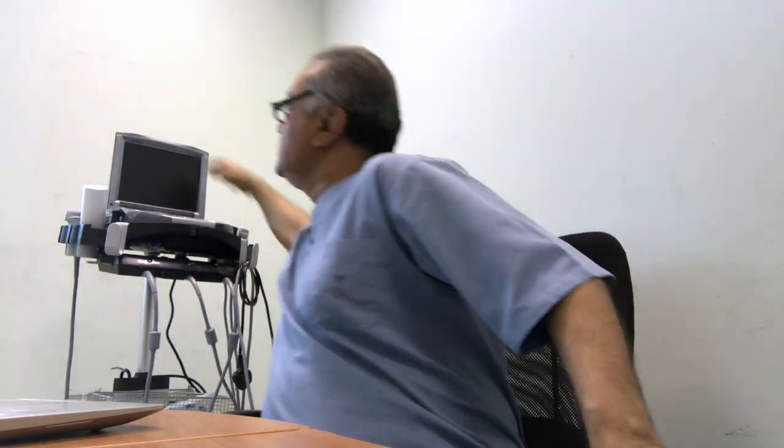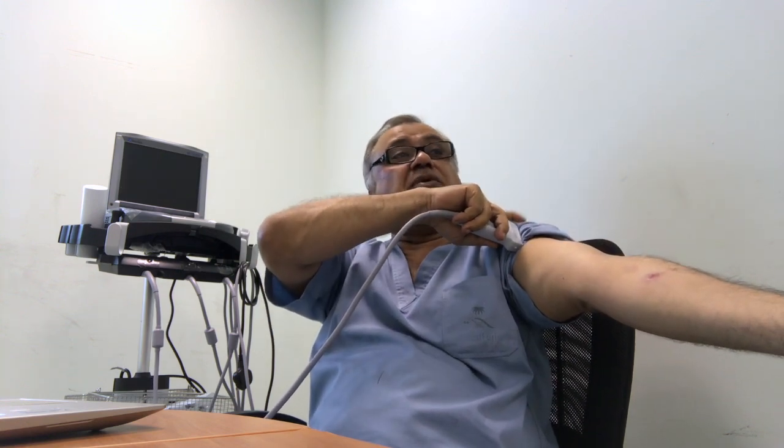Before doing any block, place the transducer in this position. I can show you, it's very good to see, but everybody knows, no need to describe. Just put it here, go down, and here. And what I learned, it's an innovation, I go like this. So your needle will be 6 to 7 centimeters inside from here. What is the benefit of using this, going lateral to the artery? I am using this. The recommended is this, 90 degrees to the artery.